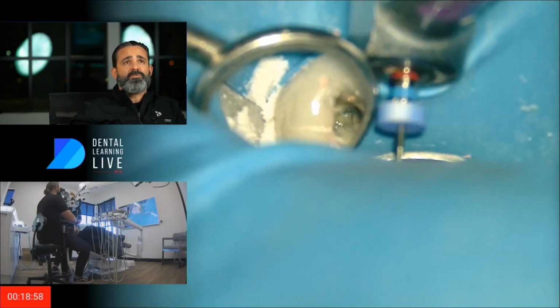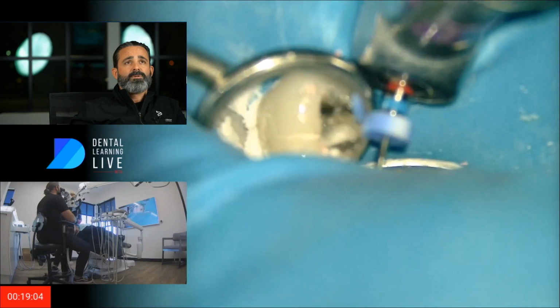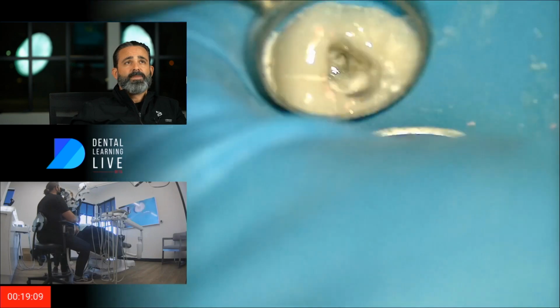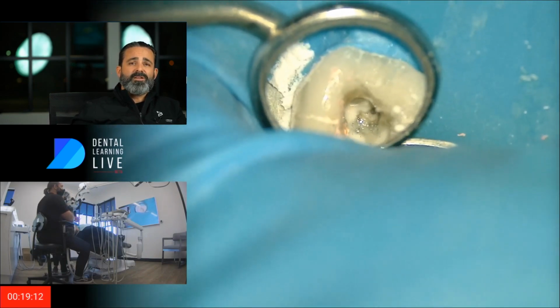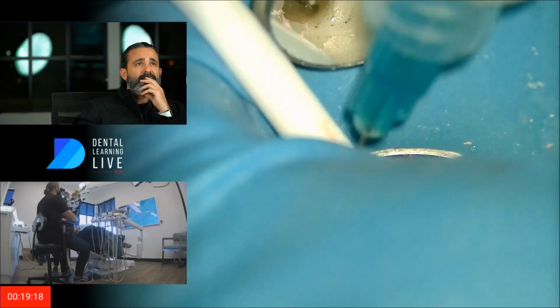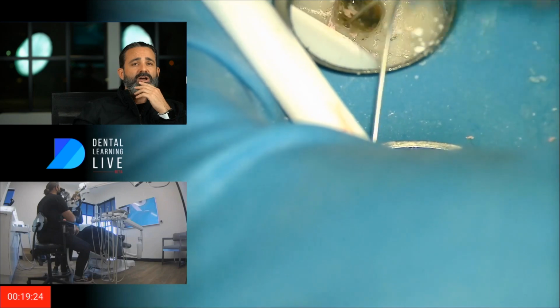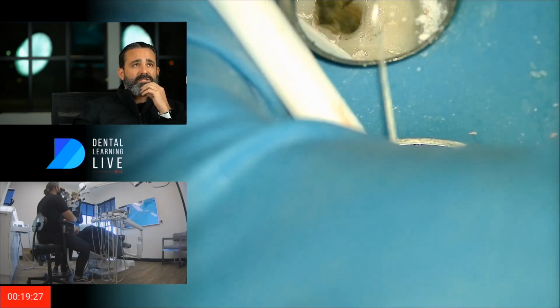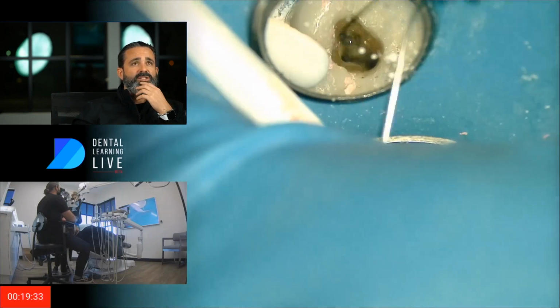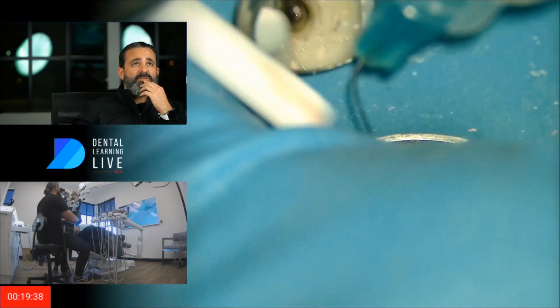And I'm actually doing this in all 4 canals, just to see what comes up. A lot of times when we smear it or just enlarge it and push it into the diameter of the canal, you could passively get a cone or a file through, but it doesn't necessarily do the job of telling you if it's still clean or if there's something trapped there. And in the MB, I have to be very conscious of that because radiographically, that's where my lesion is. So I'm thinking through that right now, and I'm going back to some more solvent.